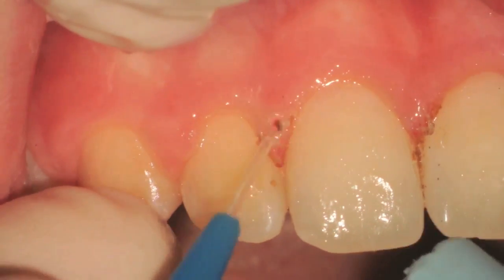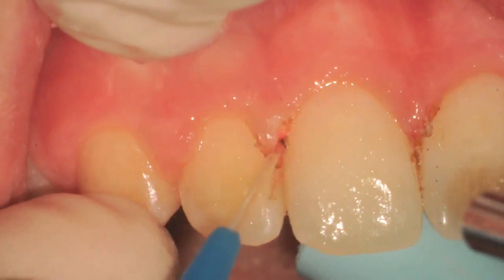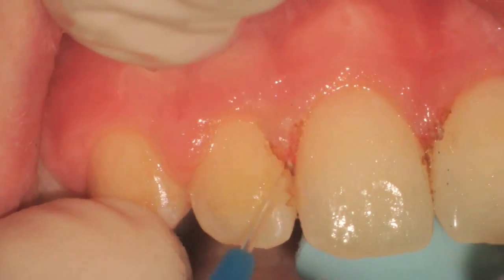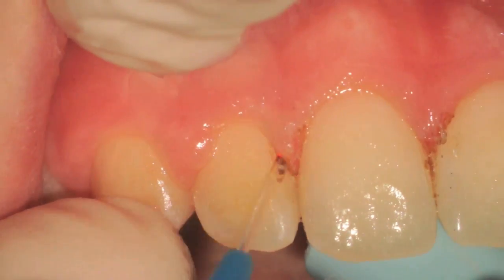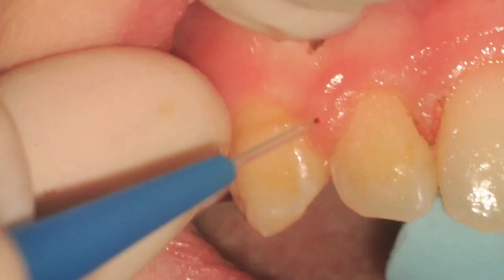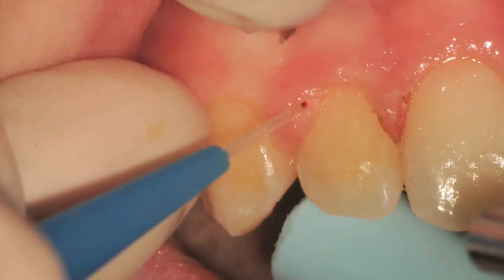You can see that we're using the straight tip in an initiated fashion to remove the bulk of the papilla. We're trying to enlarge the circumference of the gingiva and choosing where we're going to cut the gingiva back to.